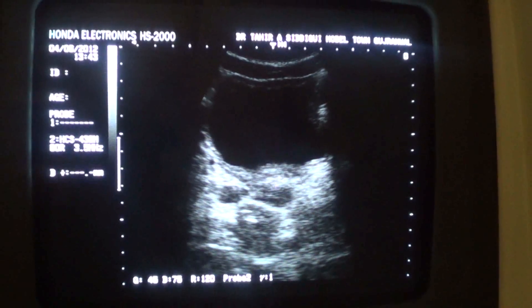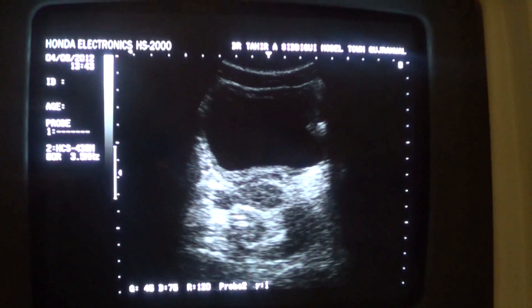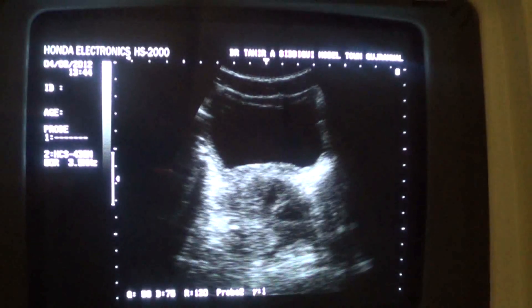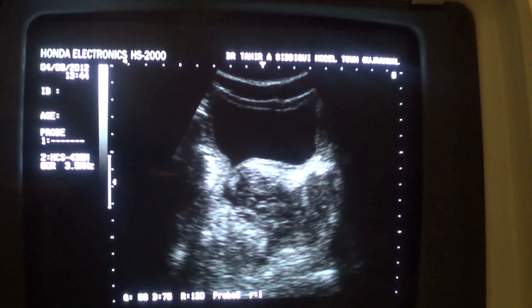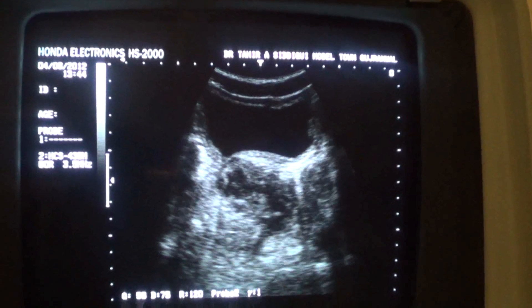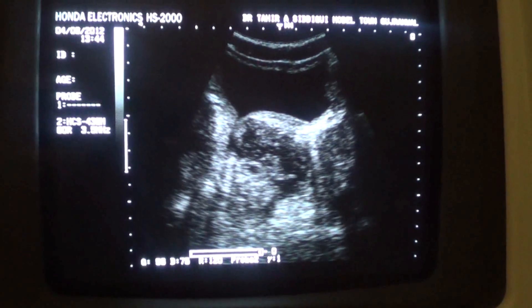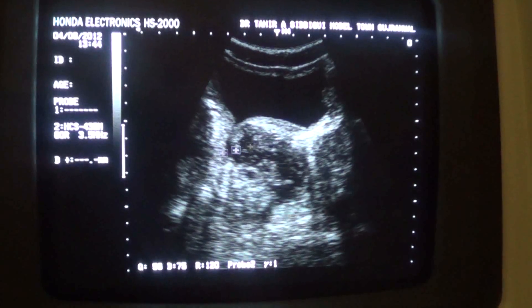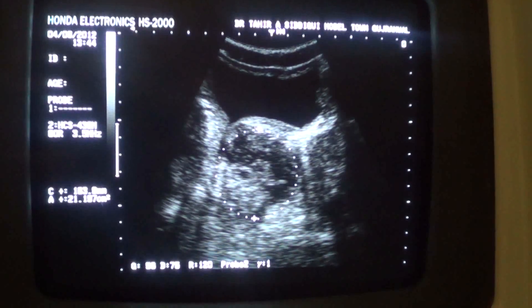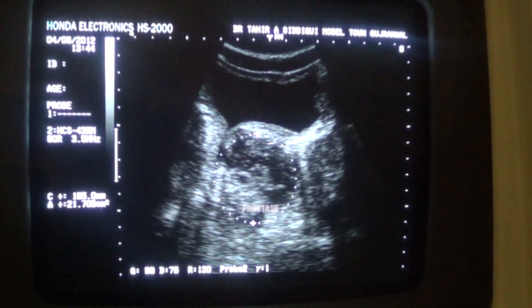Now when I move the probe further inferiorly, I come across this area which is the area below the urinary bladder. And you can see that the prostate is visualized. This is the prostate — all of this. This is the prostate in transverse section. Above it is the urinary bladder in transverse section.